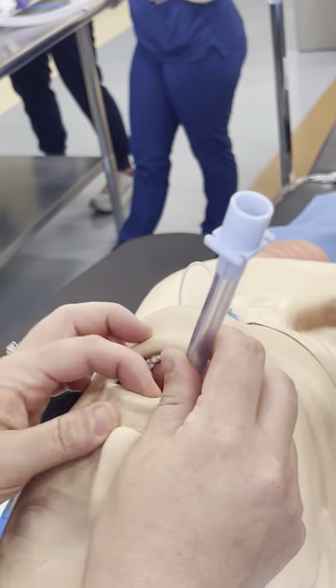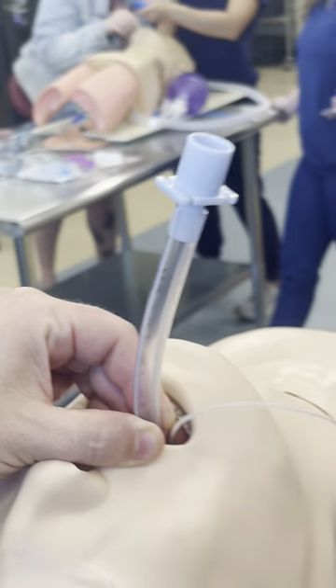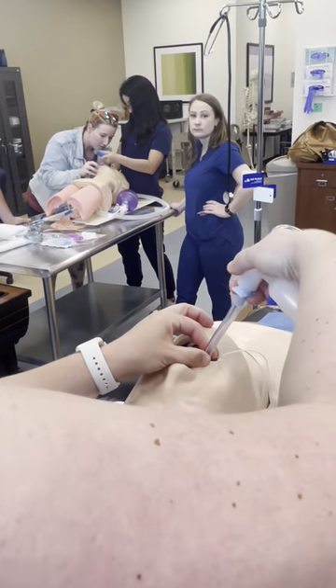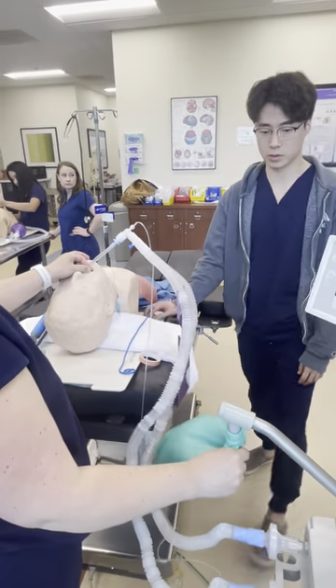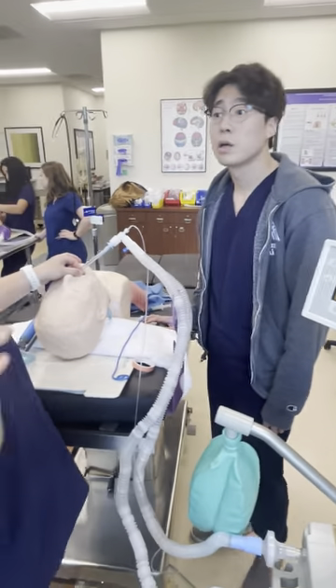All right, so I'm at 21 at the lips. Yeah. Connect, and then I would listen, listen.